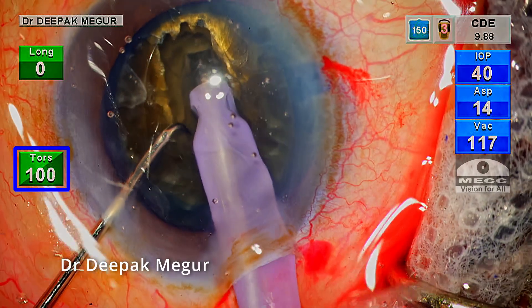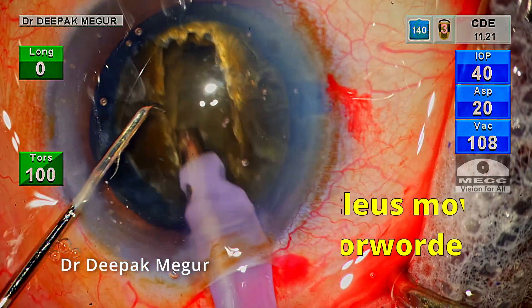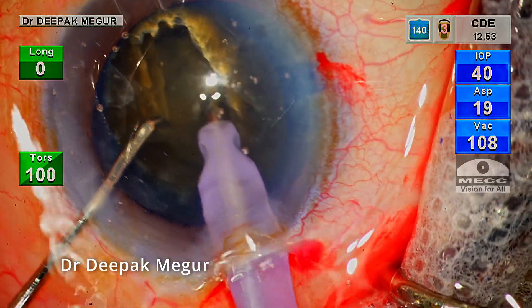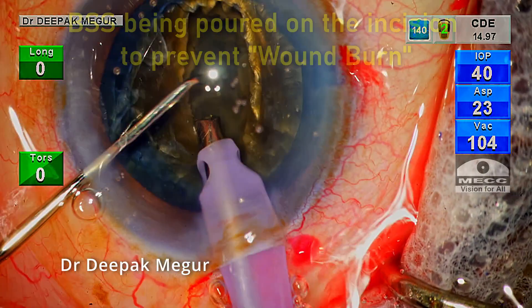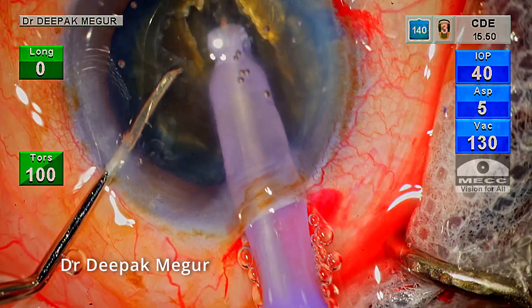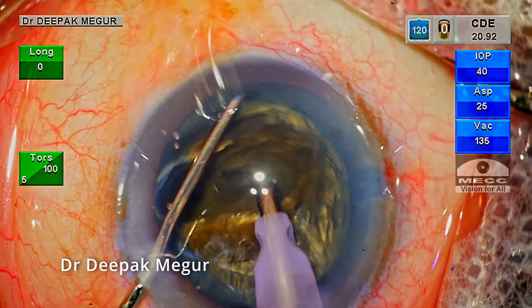Please note that I'm using 100% energy during sculpting but still it does not seem to be enough. The nucleus is still being pushed mechanically in spite of being stabilized and using the maximum amount of energy available — the nucleus is black rock, essentially granite. Once I've reached about 70 to 75% depth, the nucleus is rotated 90 degrees and a similar trench is begun.